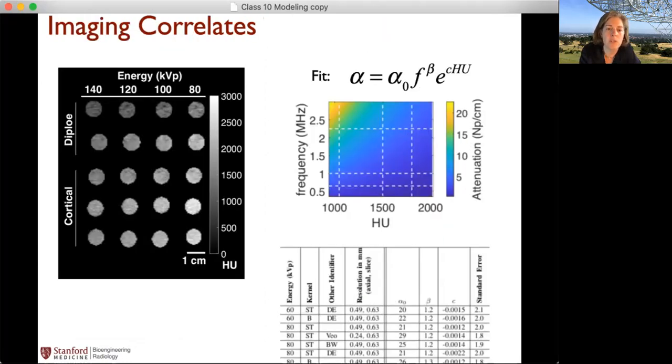What we ended up with was filling a grid that looked like this. So this was frequency this way, and then this is Hounsfield units this way. Remember, we had 100 fragments with different Hounsfield units, so we had 100 different lines in here. And then from the data in the prior slide, remember there were 3 different center frequencies for the 3 different transducers, but then there was some broad bandwidth. And so there were multiple measurements for each bone fragment in the frequency direction.